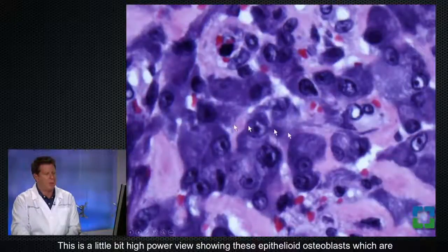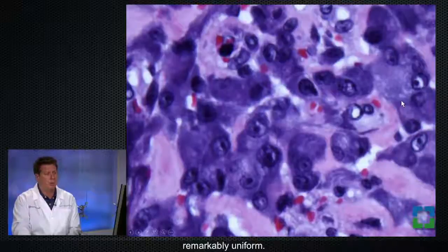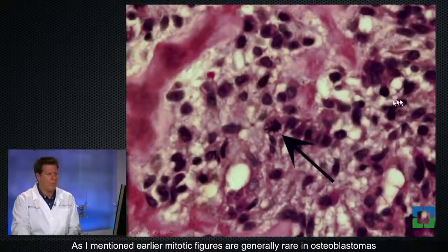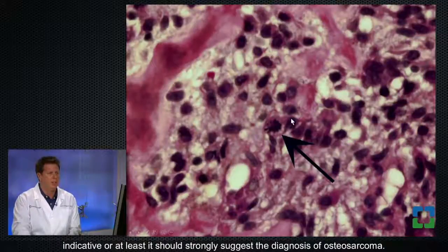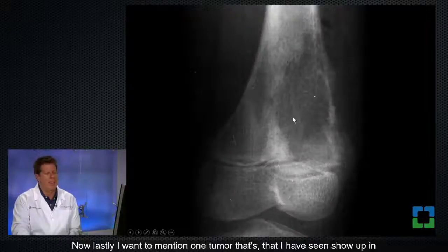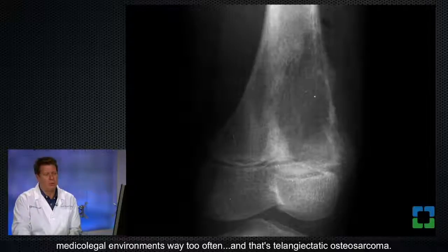This is a little bit higher power view just showing these epithelioid osteoblasts, which are remarkably uniform. As I mentioned earlier, mitotic figures are generally rare in osteoblastomas, almost unheard of in osteoid osteomas. So if you see a mitotic figure, it's really indicative, or at least it should strongly suggest the diagnosis of osteosarcoma.